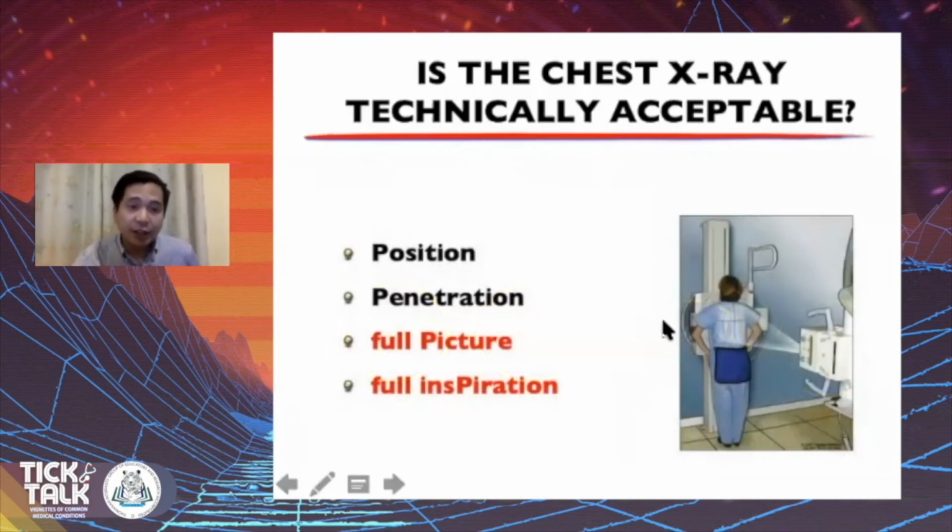Now we go to the third and fourth P, the full picture, and the film should be taken on full inspiration of the patient. Okay?